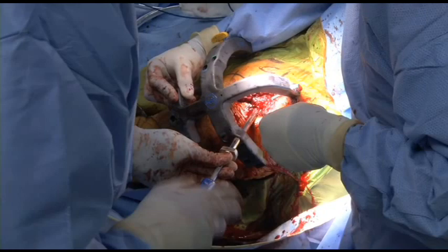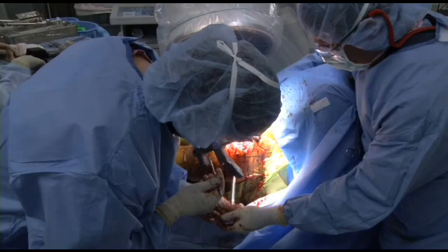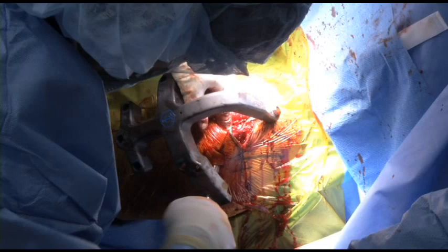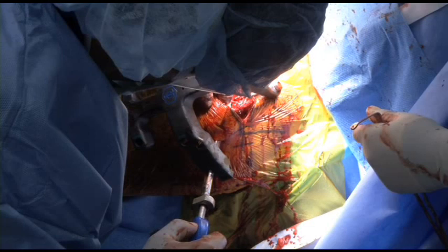The first greater tuberosity is drilled, measured, and the screw placed. In this case, a long screw was placed abutting the undersurface of the subchondral bone of the anterior superior humeral head, as the bone quality was good and maximum support of the initially inferiorly displaced humeral head was desired. The second greater tuberosity screw sleeve is placed percutaneously directly to the bone, first making a small skin incision and then spreading the deltoid. The screw is drilled, measured, and placed. The drill sleeve has a posterior to anterior orientation. Screw advancement becomes more difficult as the screw compresses the tuberosity against the nail and humeral head. Only two finger tightness is required; vigorous over-tightening will cause perforation of the screw head through the tuberosity cortex and potential loss of fixation.